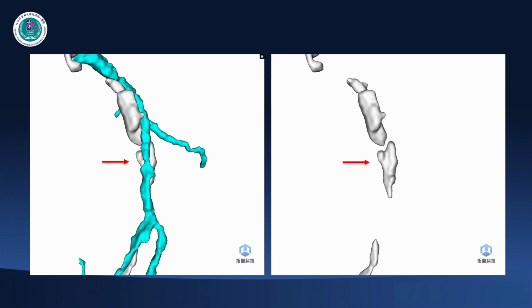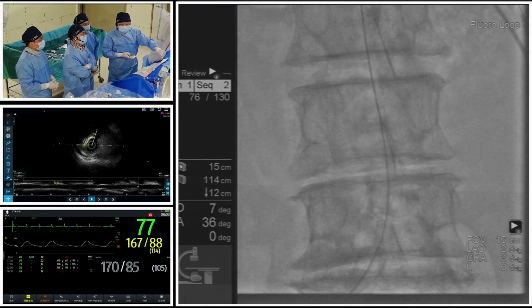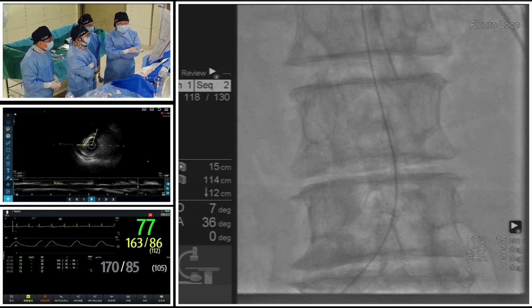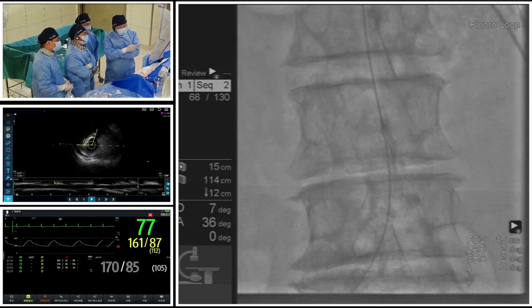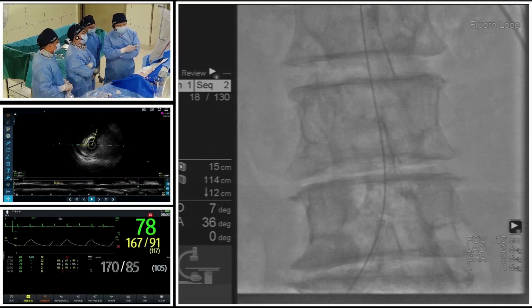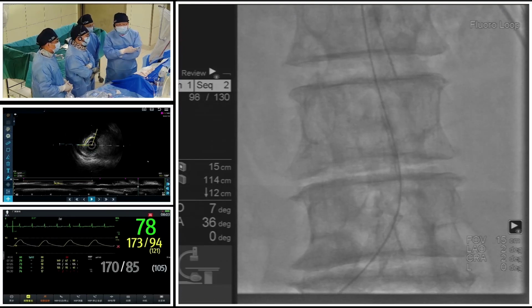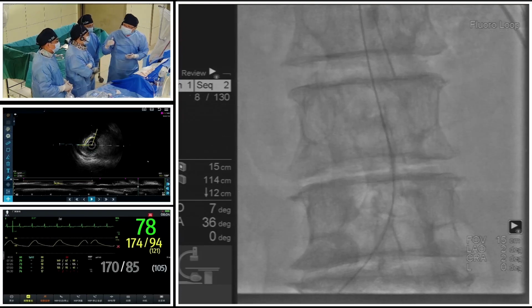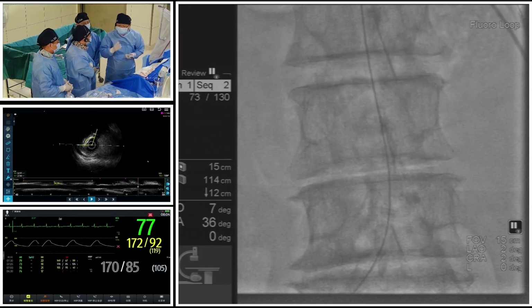Next. Okay, this time we delete the light blue LAD. We can see the distribution of the calcified plaque clearly. And here is a small tip and trick that I already showed to the audience, because we can see the abdominal aorta also has severe calcification, and the guiding was a little bit difficult to advance further, and there should be a calcified plaque. If we forcefully advance, even if we rotate the guiding, it still couldn't cross.